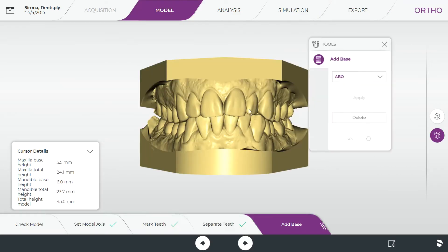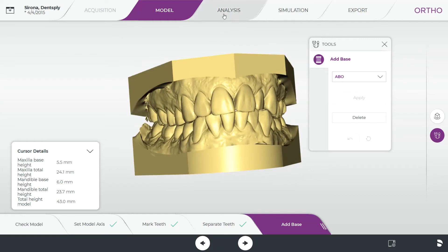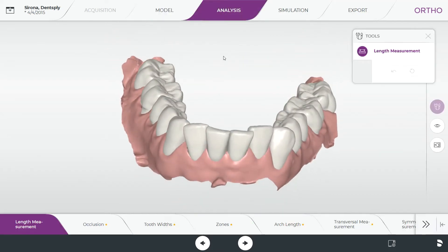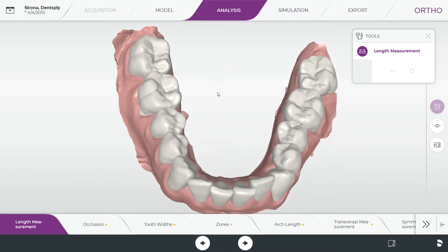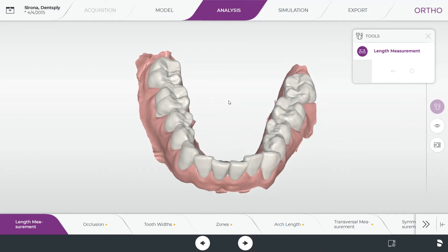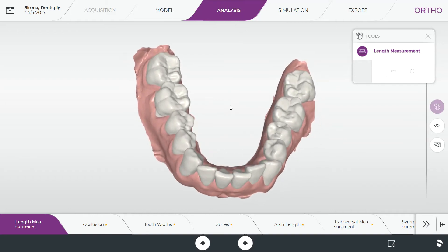Next, go into the analysis phase. You can actually skip this entirely if you're simply using the software to do a simulation for the patient to see what they could look like after clear aligner therapy. Analysis is really meant to substitute doing manual measurements on a model — for traditional wire and bracket cases or if you like to take physical measurements, the software does that for you.